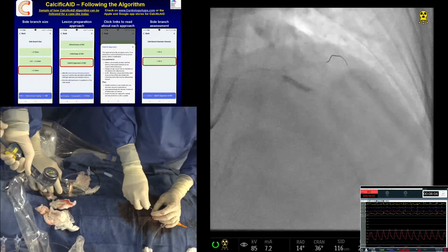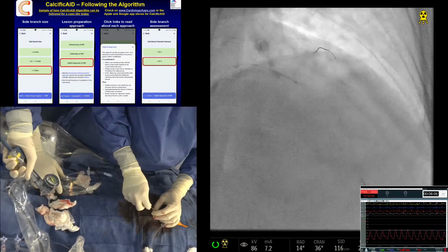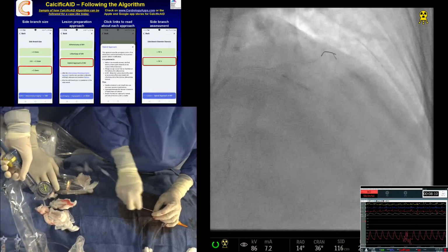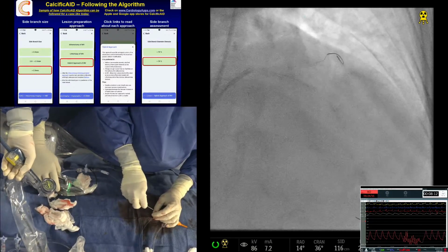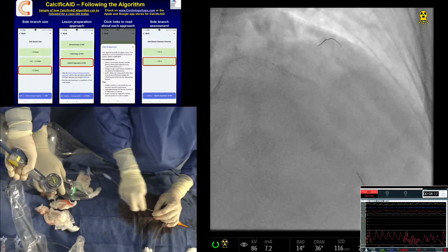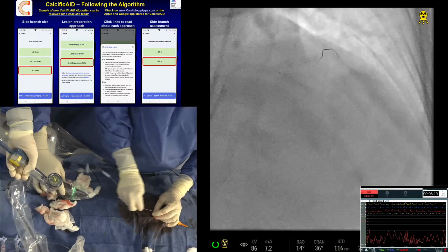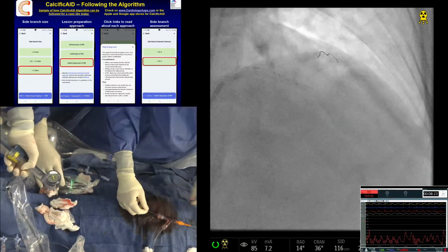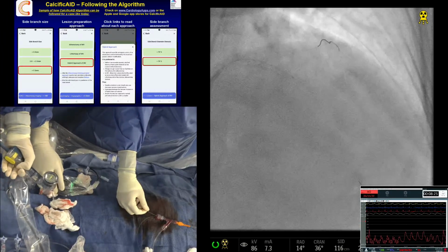Okay, down. Think we're good, right? Let's do one more and boom. Not going. Okay, just leave it there. Go. 6. Want to try the diag or leave it?